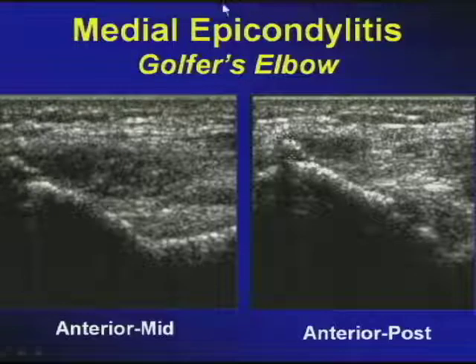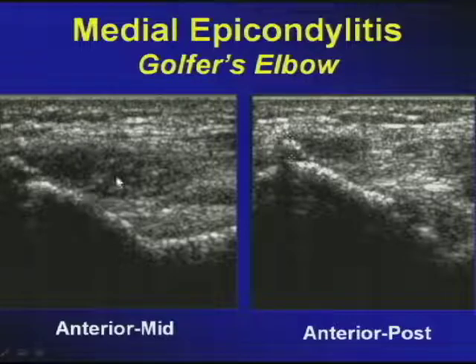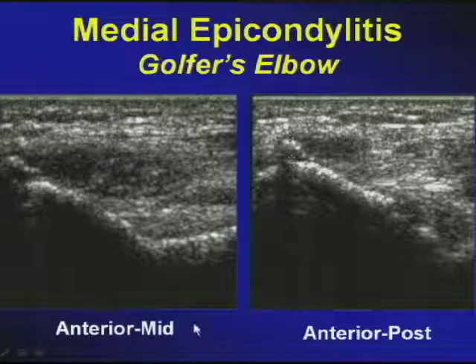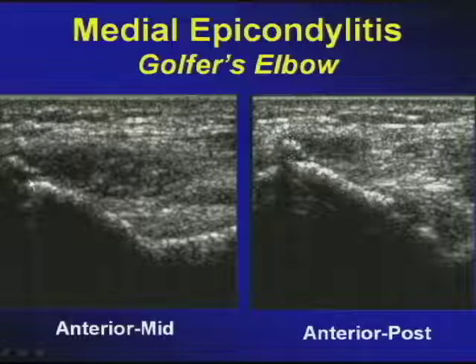When diseased, medial epicondylitis may also be called golfer's elbow. This is what you get to see. The ultrasound shows fusiform hypoechoic swelling of the tendon, loss of the echo signature of the fibrillar pattern, and alongside that, you'll also see some cortical irregularity. Depending on your slice selection, whether you're cutting it on the midpoint, you not only see an unfused heterotopic ossification or spur, but also maybe even some cortical hyperostosis and or maybe a healed avulsion fragment.